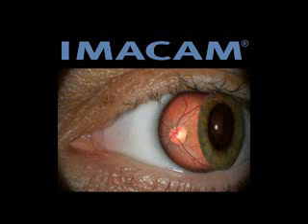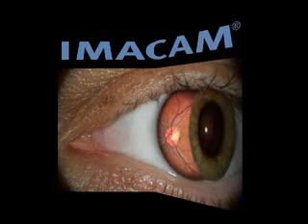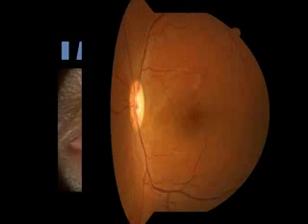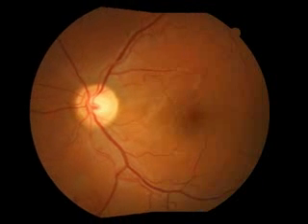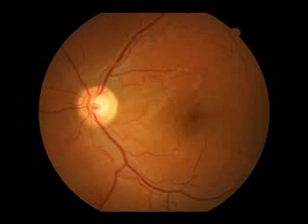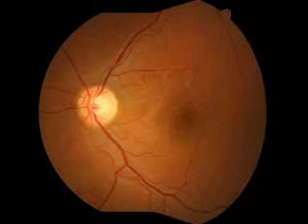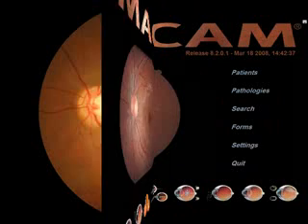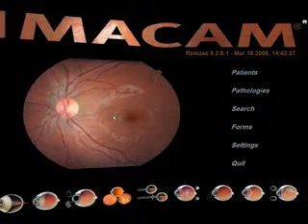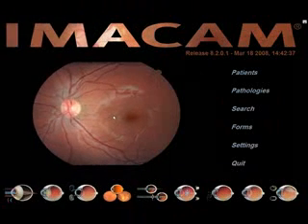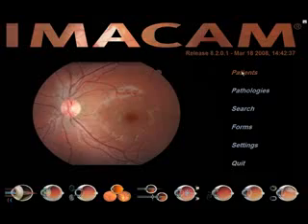Welcome to the iMacam tutorial. Creating a patient file.